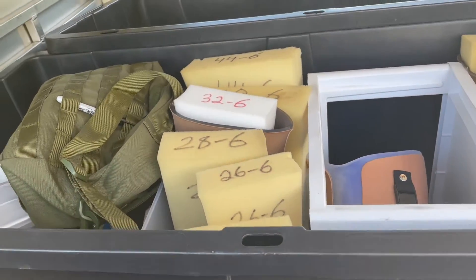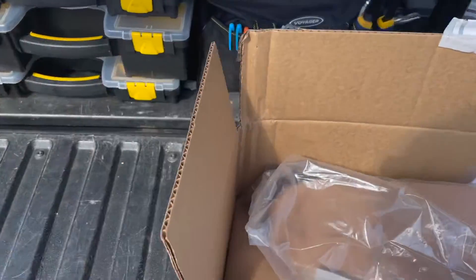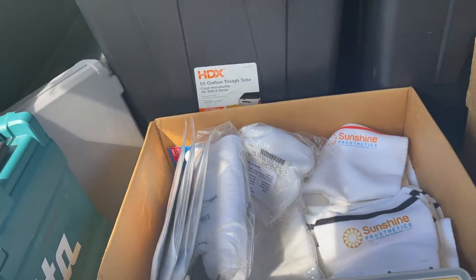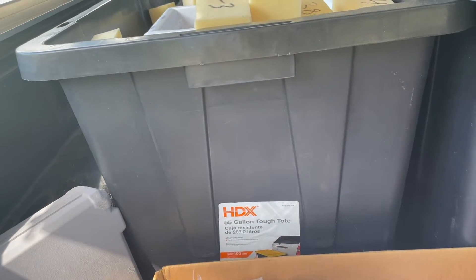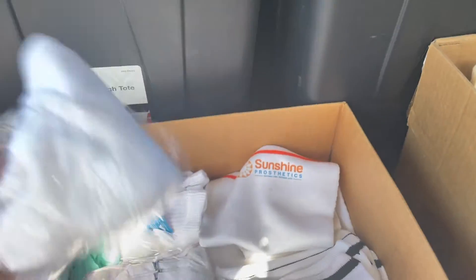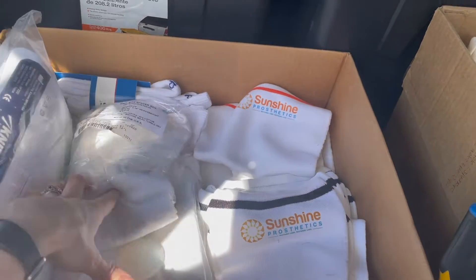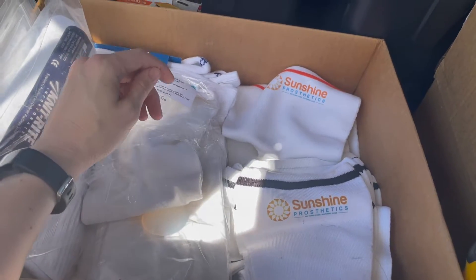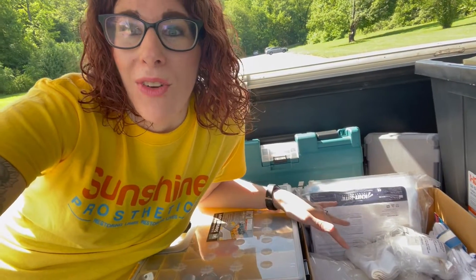I have a set of liners — six millimeter liners and three millimeter liners. Moving to the next box: a set of below-knee shrinkers and above-knee or transfemoral shrinkers. And then a set of socks that we provide at delivery in two different thicknesses and a pack of single-ply socks as well. So when I'm ready to do a delivery, I can just jump to this box, grab what I need, or if I need one for a fitting, they're all right here and ready to go.